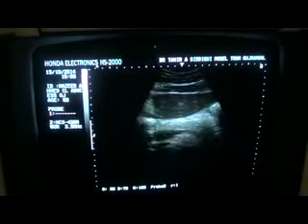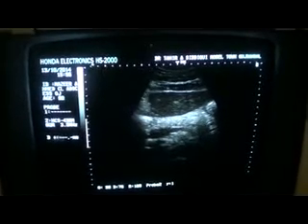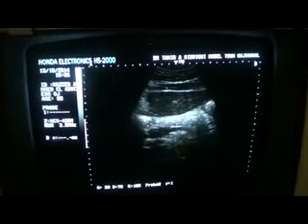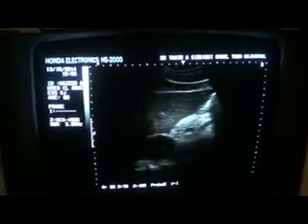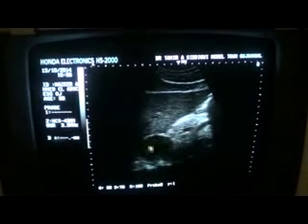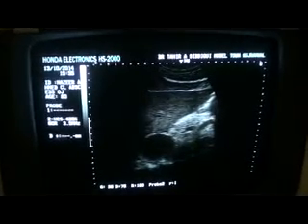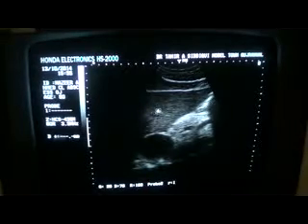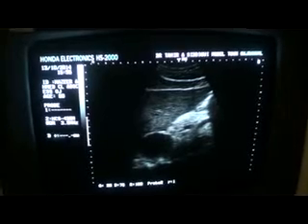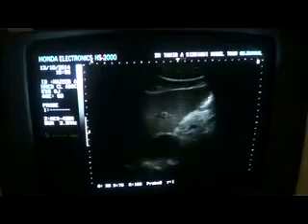Now we see that the pancreas is normal. This is the pancreatic band. This white band is the pancreas. This is the splenic vein. This is the mesenteric artery. This is the aorta. So this is the head of the pancreas. Again you see the pathology of the caudate lobe. This is the aorta. This is the superior mesenteric artery arising from it. These short segments again show intrahepatic bile duct ectasia. Now this is the head of the pancreas in longitudinal section. This is the portal vein.